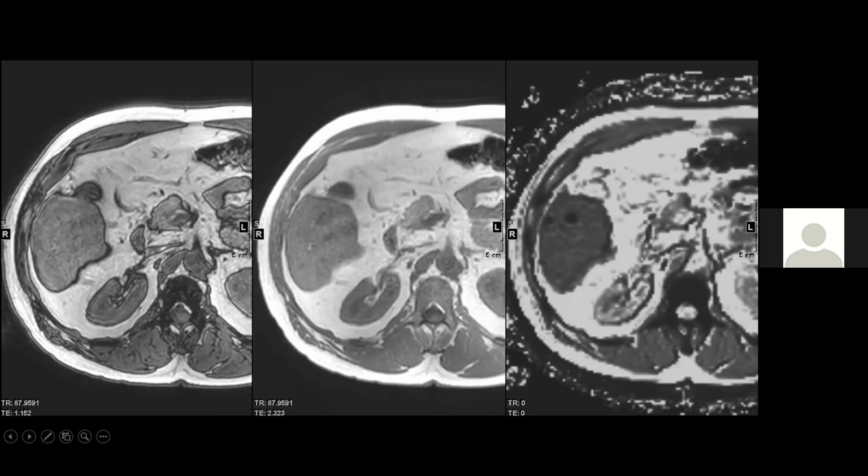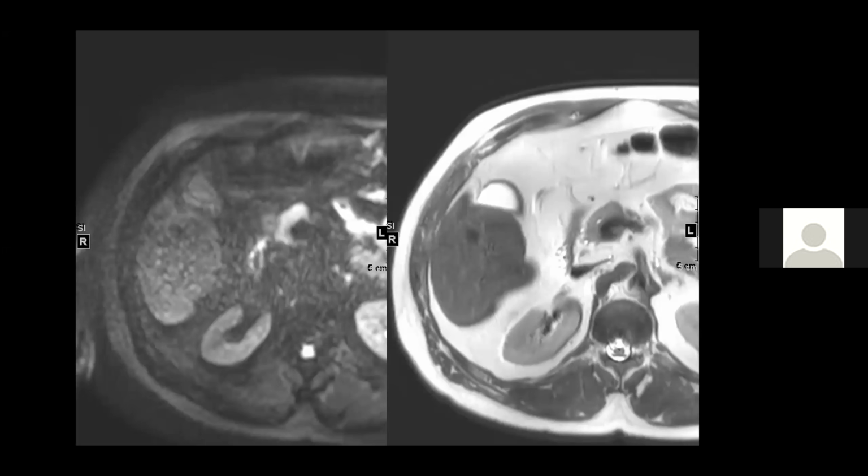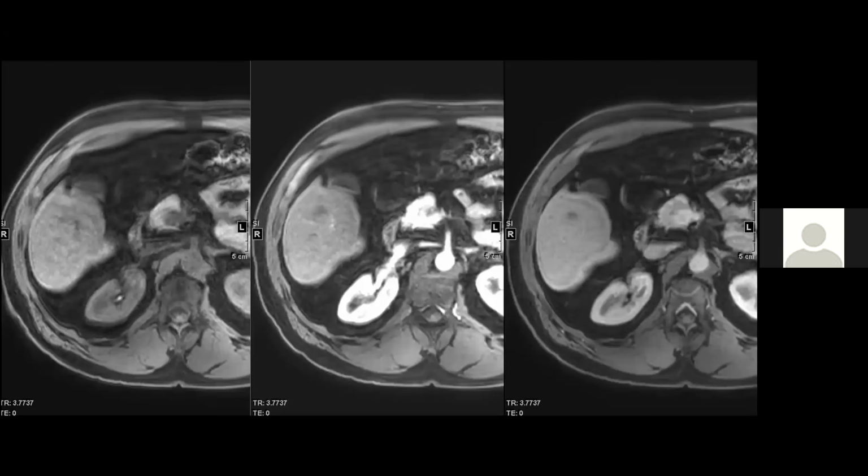Victoria, I have a question. If you go back one slide, you know how you were saying one more slide to the pre-post. Sometimes I will call this pseudo washout because it's low the whole time, and then everyone told me pseudo washout is not a term. I guess you're using the term washout appearance because it's not truly washout, and in this case we know that it's not truly washout. Would you even just say, why are we even calling it washout appearance if it's kind of low the whole time?